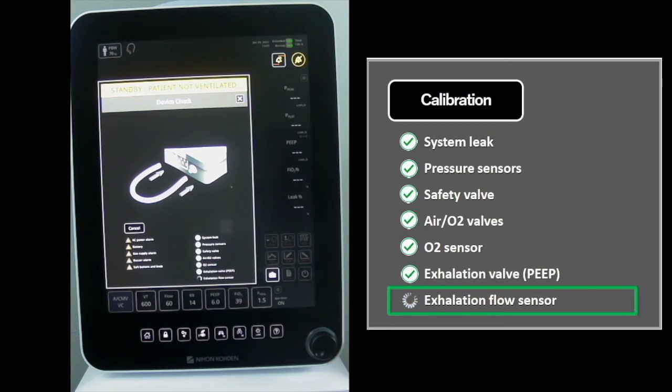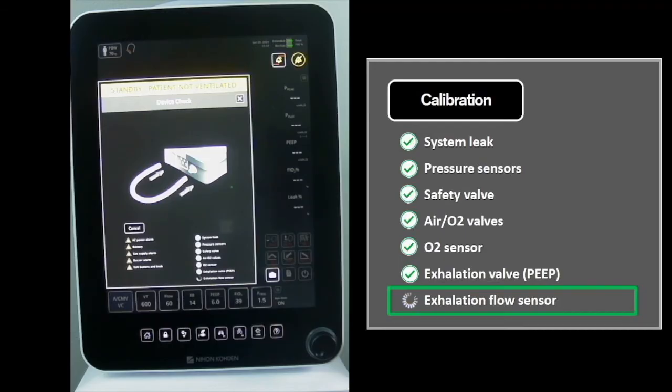The Exhalation Flow Sensor Test is comprised of two stages. During the first stage, the exhalation flow sensor is calibrated against the internal inspiratory flow sensor. During the second stage, accuracy of calibration is verified at 30, 10, and 3 liters per minute.